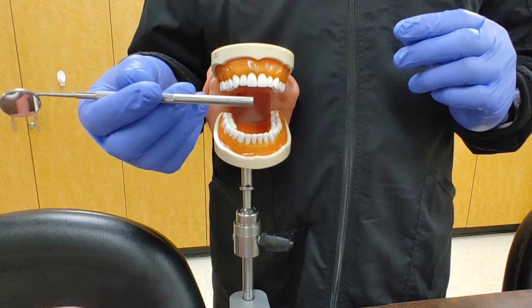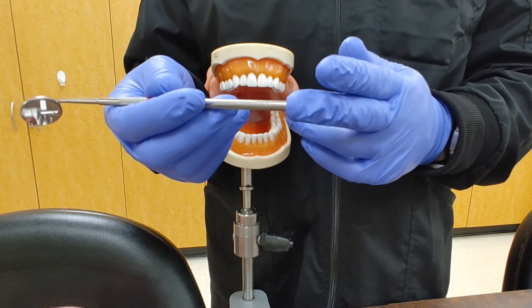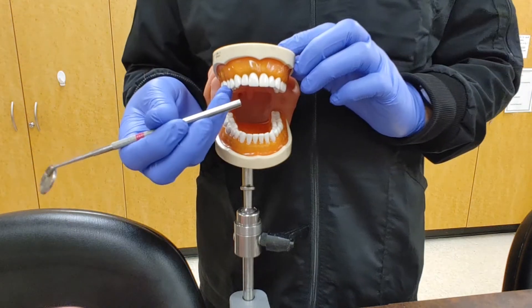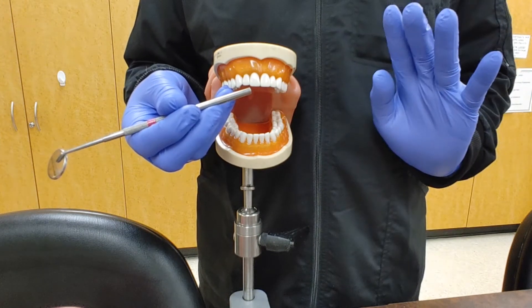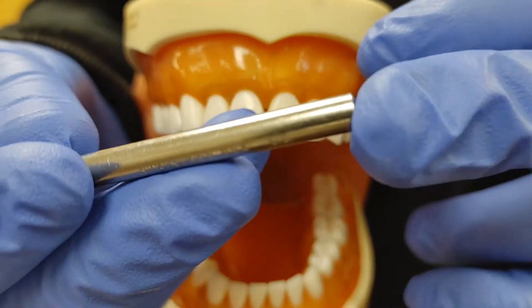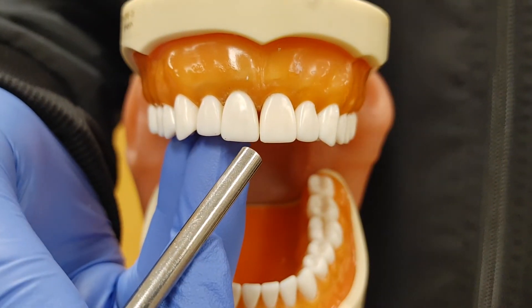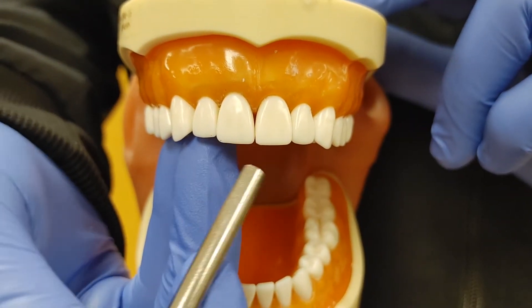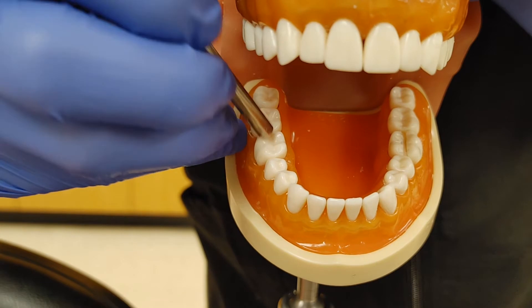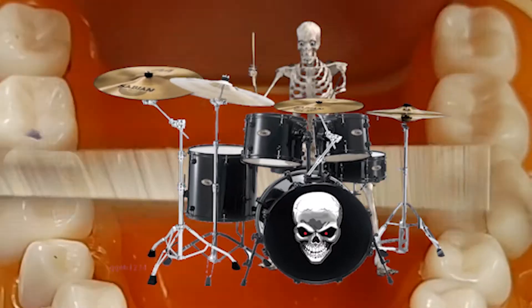The next test is the percussion test. We'll use the back end of the mouth mirror to apply a drum-like tapping force consistently onto the teeth we've been testing. Have your patient raise their hand if they feel any pain or abnormalities, then jot the information down. It's normal for there to be some annoyance from tapping on the teeth, but there should be a noticeable pain if the tooth is sick or abscessed. Apply consistent tapping pressure on the cusp or incisal edge of each tooth.